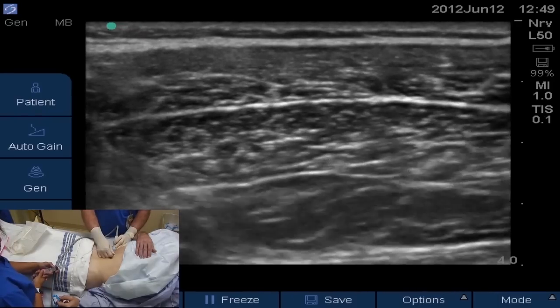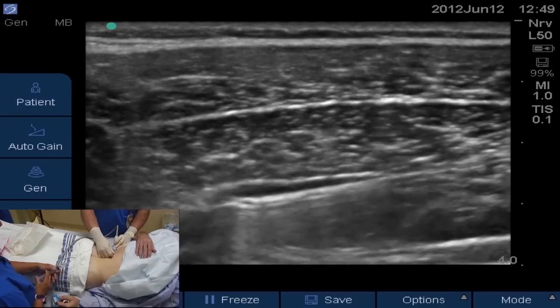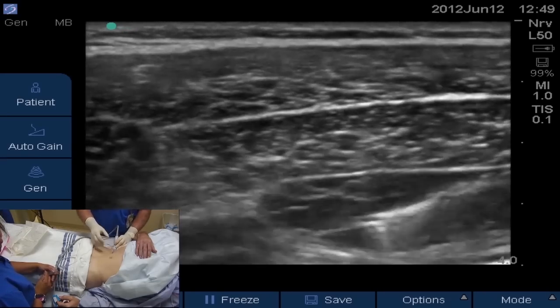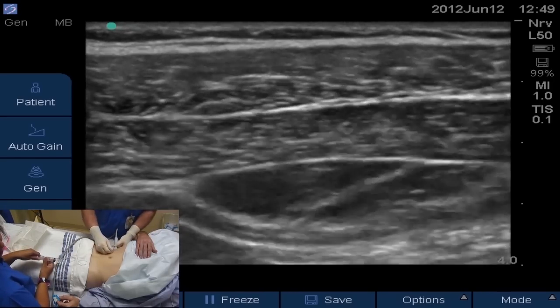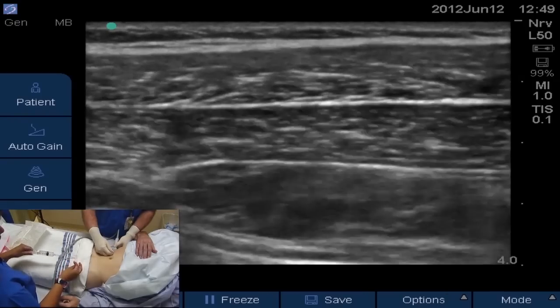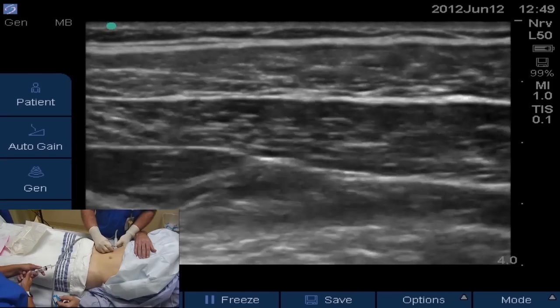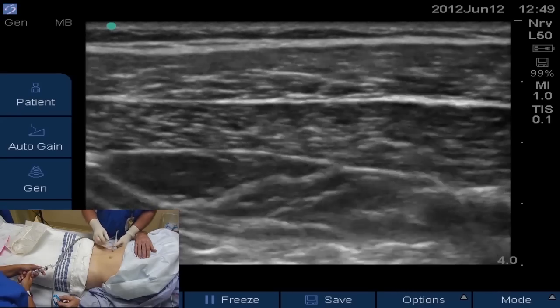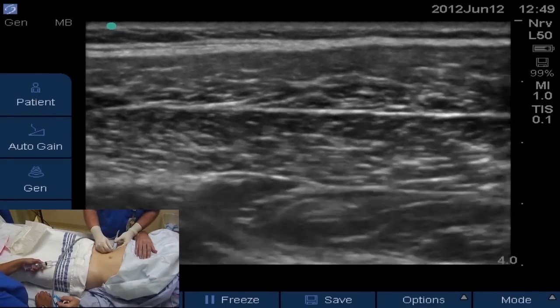That's where you're going to get a more extensive block covering multiple levels. You can block as much as T7 to L2 with high volume placed posteriorly. We've opened up this plane extremely well — it's a beautiful picture with a great view of the needle. As we come through opening up this plane and try to get more posteriorly, of course with the abdomen it's constantly moving, so the needle comes and goes. Now we can see it again well.